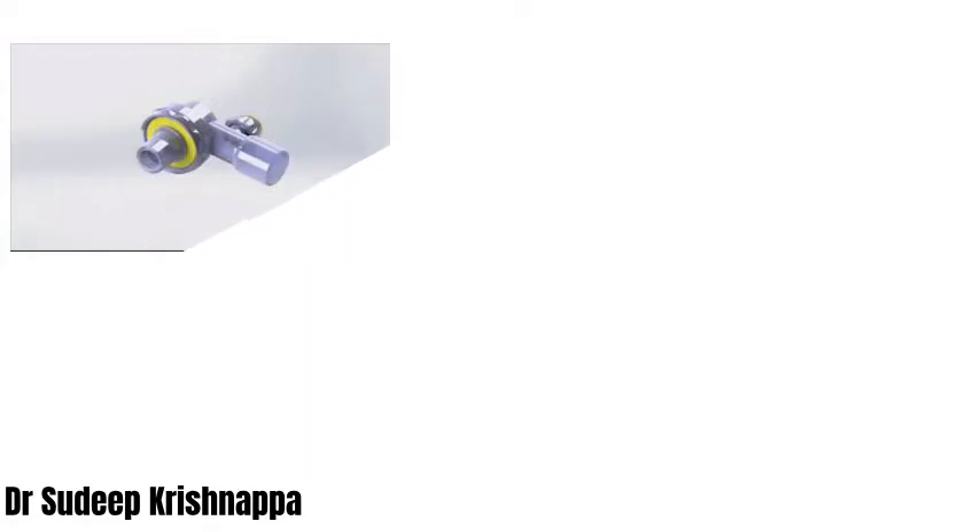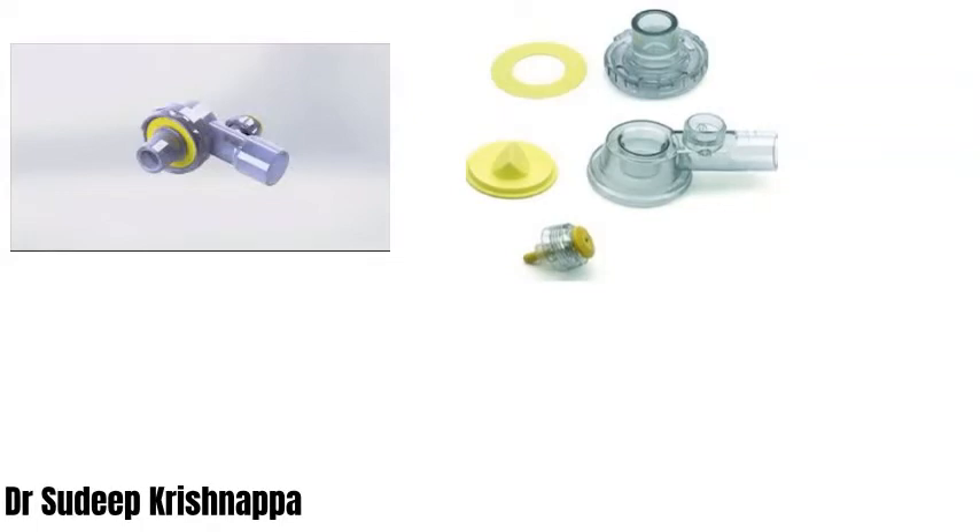Now let's have a look at the patient end of the resuscitator. The patient end has been detached and kept separately, and it can be disassembled into several components. The first component is a pressure limiting valve, generally present in pediatric resuscitators. Next is the outlet which connects to either a face mask or a supraglottic or infraglottic device so that ventilation is possible. There are six openings around the patient end through which the exhaled gases move out of the system.